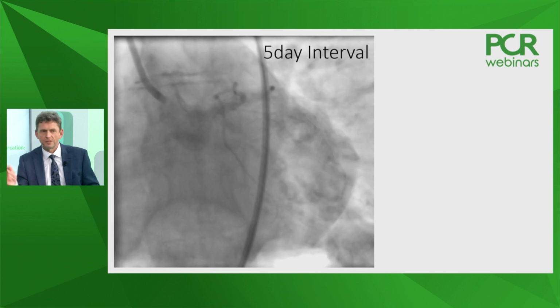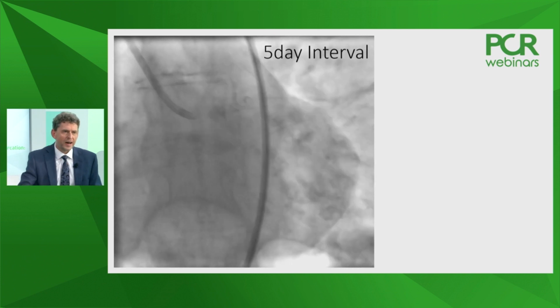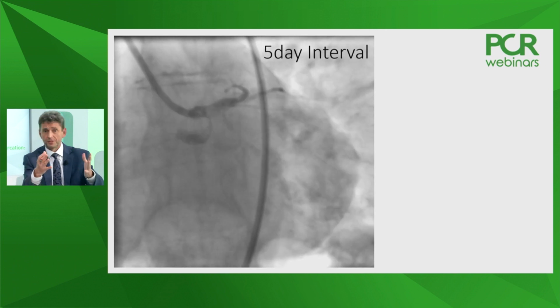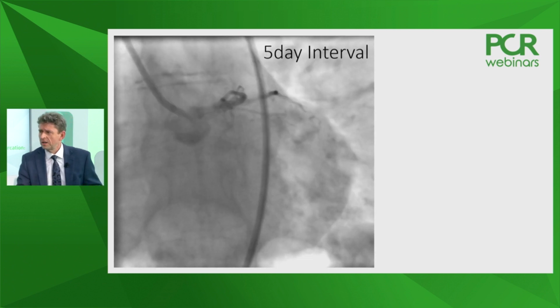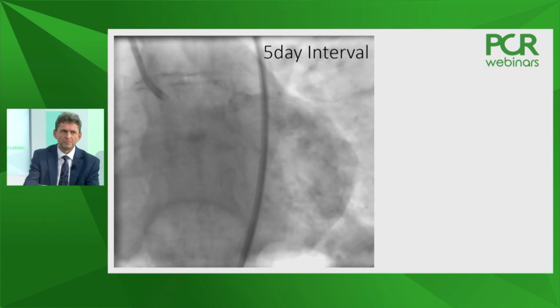Yeah, of course, now the situation has changed. We can discuss whether it was worth waiting those 5 days, but I think that's another story. So definitely we should try to open the vessel, but what one of the participants asked, and also what Tom has mentioned, I would love to see the IVUS of this lesion, because we can very easily mix up the calcium with thrombus. And now, since we have ACS patients and the vessel is closed, perhaps that's more thrombus than calcium. Of course, we see a lot of calcium on angiography as well. So I think the IVUS will be a great tool, after reopening the circumflex at least. Okay. Tom, I guess you did IVUS.